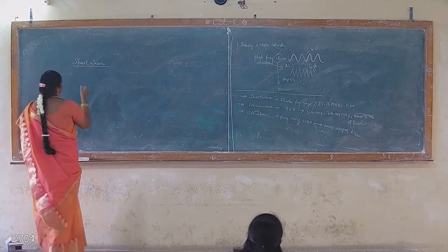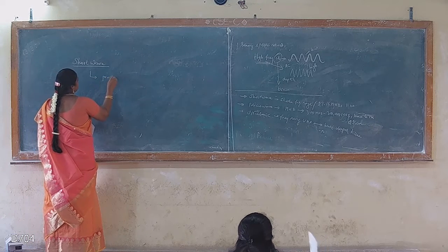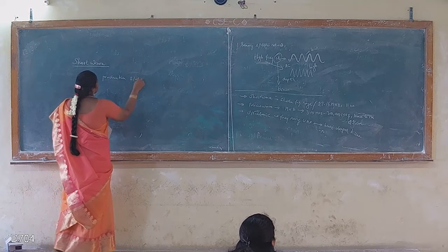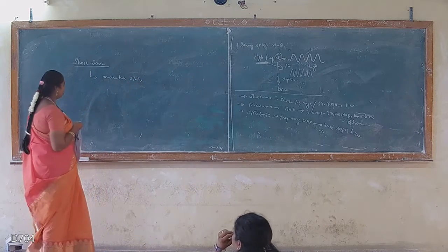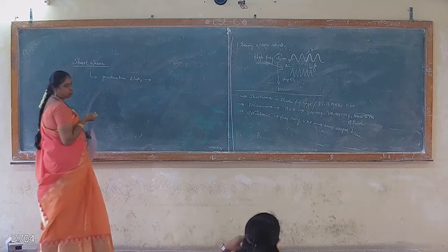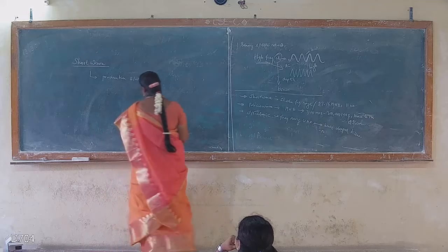In the shortwave diathermy, the most important thing is the production of shortwave. The first diathermy unit which was established is the shortwave diathermy unit only.